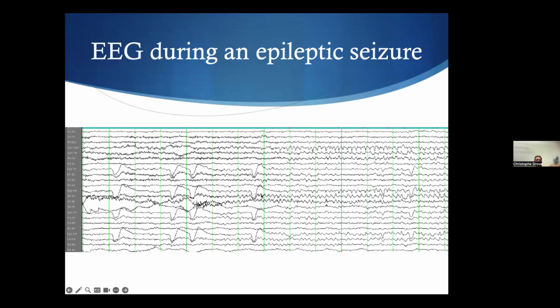This is an example of an epileptic seizure, patient sleeping, you have a few eye blinks, and then you see some rhythmic activity that is starting there. So there are a lot of different epileptic seizures. What is important here is this rhythmic activity that you see. Probably at that time, the patient is not moving that much, but if the patient starts moving, especially you might have seen some seizures where they move the head or they jerk, your EEG is going to be completely contaminated with muscle artifact. So it's going to be quite difficult to analyze.